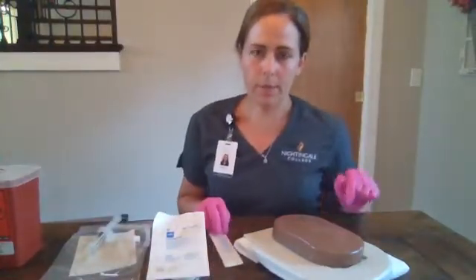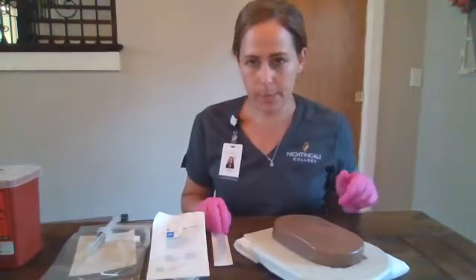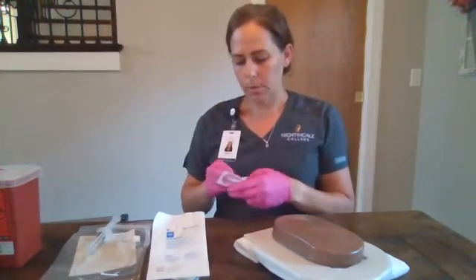My patient is a 75-year-old male who's here for fluid rehydration. We're not anticipating surgery and we're not anticipating blood products, so I'm going to insert a 22 gauge. We will pull that out.